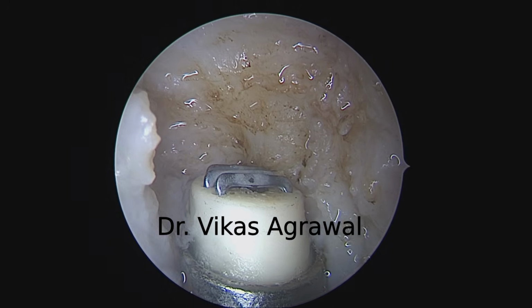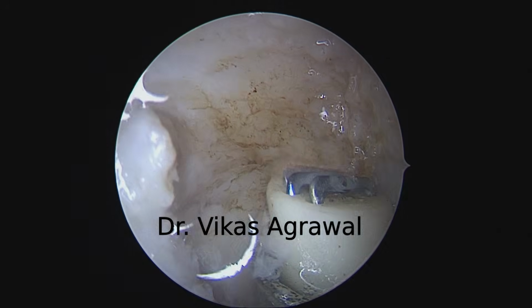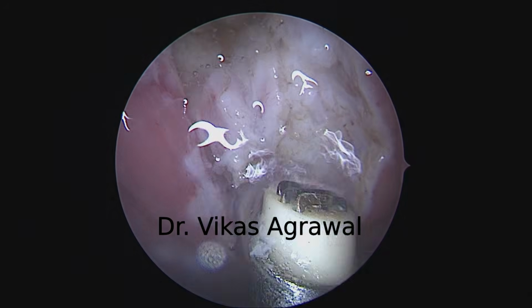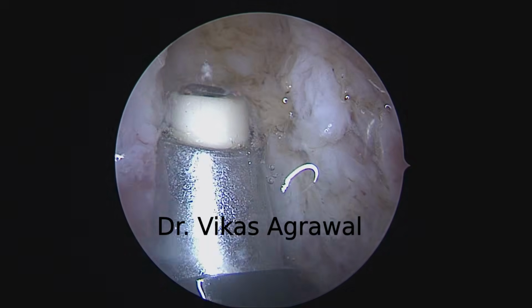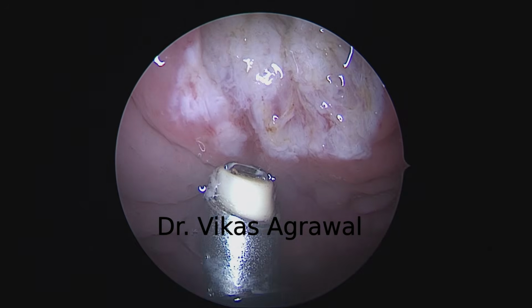You see that? That's the buccopharyngeal fascia. I'm not going to open up the fascia, I'm only going to define the fascia. Can you see? This is the fascia. All this lymphoid tissue has to be removed in order to complete the surgery. This is the inferior boundary, which is the Passavant's ridge.